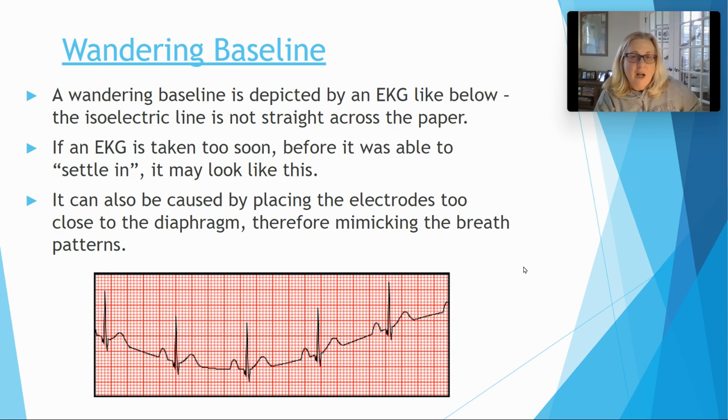And if it's there close to the diaphragm, it will mimic the breath patterns, especially if they're short of breath. If for any reason you have a patient that's short of breath, excuse me, and you have it close to that diaphragm, you're going to see this all over the place and it's hard to do anything. So just make sure they're off the diaphragm. And then if for some reason you had to move the stickers off the ankles and you moved them up to the abdomen, again, keep them away from the diaphragm.